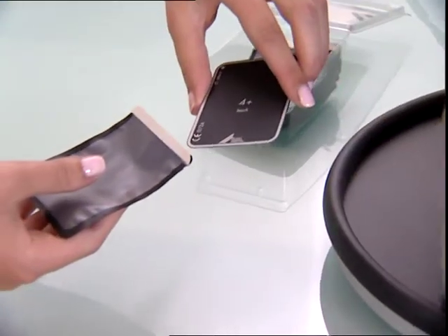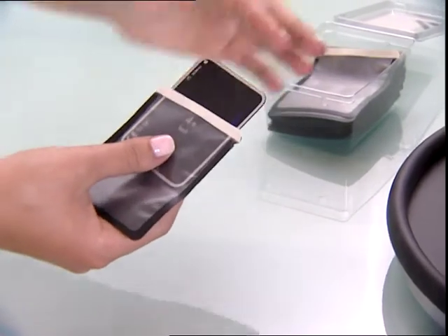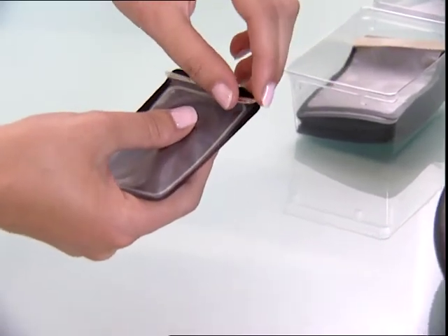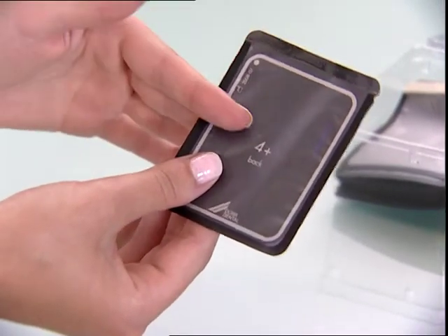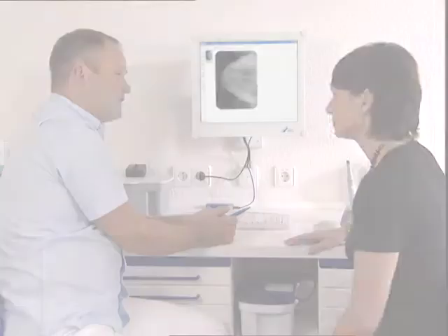The handling of the VistaScan Combi Plus is simple, intuitive and time-saving. The patented image processing functions of Dürr DBS WIN are a solid basis for your digital x-ray diagnostics.